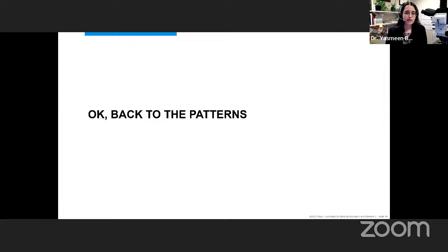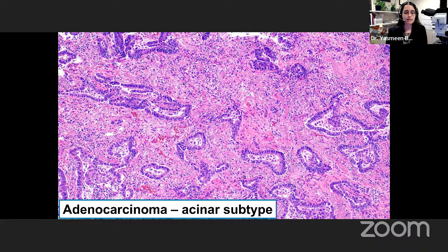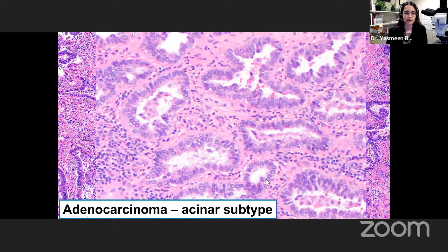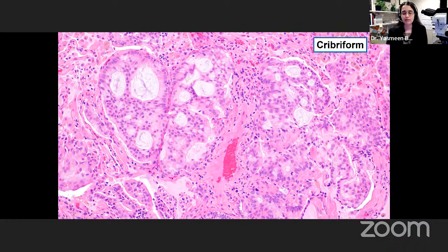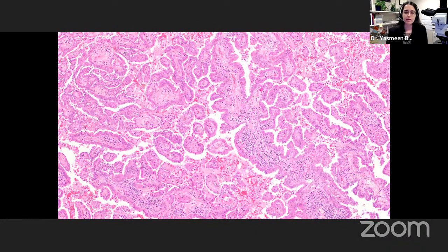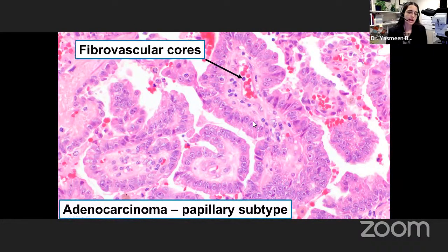A quick review of adenocarcinoma patterns you need to recognize. Acinar subtype is one of the most common — classic angulated glands, hyperchromatic nuclei, desmoplastic stroma. Cribriform or complex glandular patterns are considered high-grade even though technically acinar (intermediate grade), so remember that distinction. Papillary pattern is another very common architectural pattern, synonymous with invasion — you see distinct fibrovascular cores, just like papillary pattern in any other cancer.